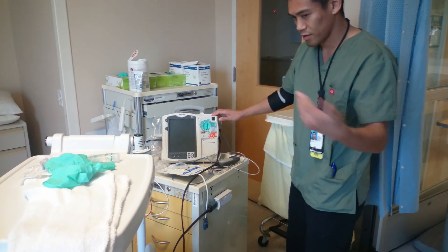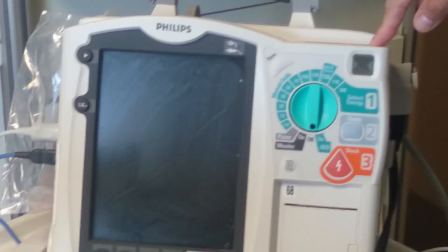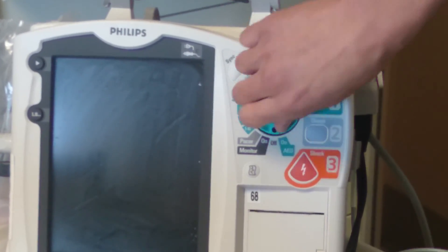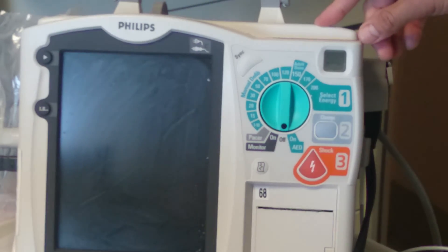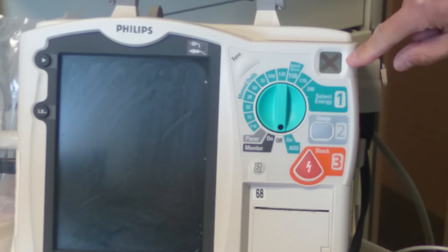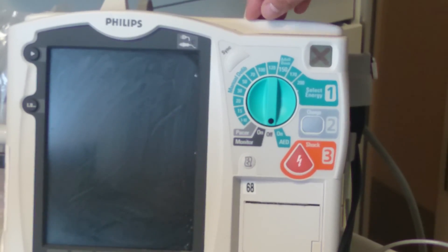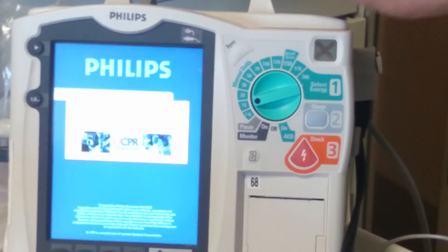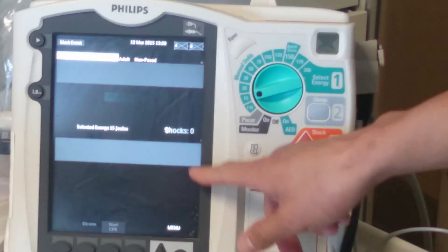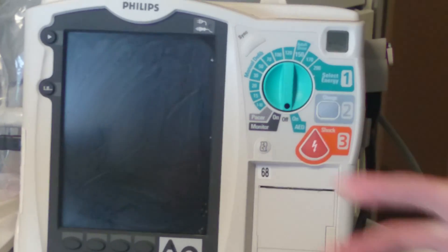You want to check your function window right up here and make sure that the hourglass is showing. Sometimes what you'll encounter is it'll have an X, and you want to reset it before you do any testing. The way you do that is you turn it to any joule setting and let the screen boot up, and it will turn back to the hourglass if there's nothing really wrong with it.